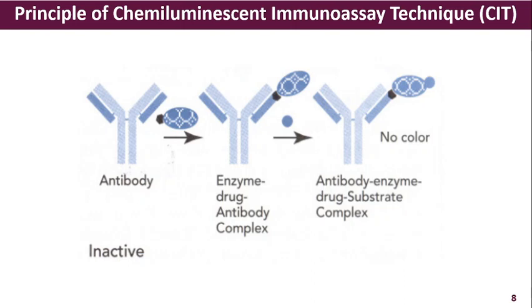On the other hand, if the sample does not contain the target drug molecule you are investigating, it could be hormone, anabolic steroid, abusive drug, or abusive drug metabolites. If they are not present and a corresponding antibody is added, that antibody will readily engage the drug enzyme complex on its FAB site.